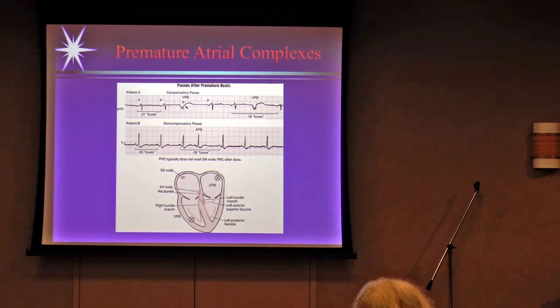So what you're going to see here, they have terms compensatory pause and non-compensatory pause. Don't worry about it. What we really care about is, did the complex generate a pulse or not, right? In other words, is it helping to keep the patient awake and alive, or is it not helping to keep the patient alive? If it just electrically fires and doesn't generate a pulse, it's obviously going to slow down the heart rate, because after that PAC fired, the heart still has to relax and get ready for the next one, right? So you would like if the PACs actually generated pulses.